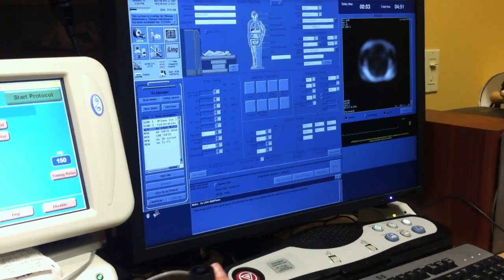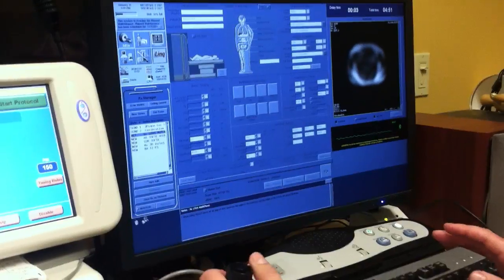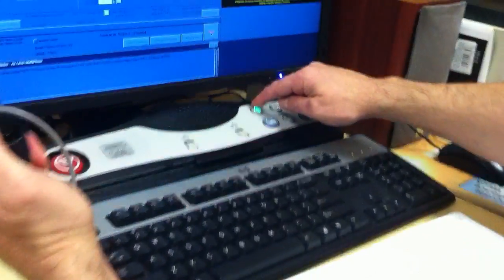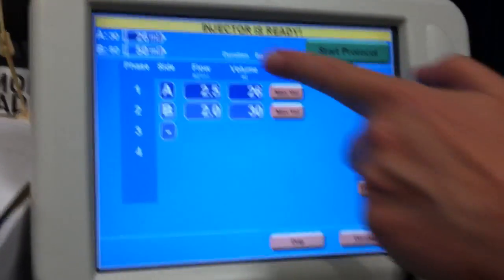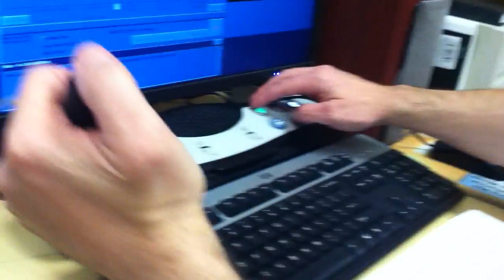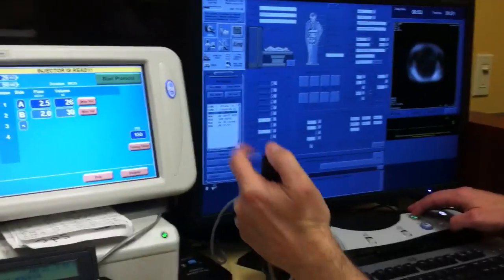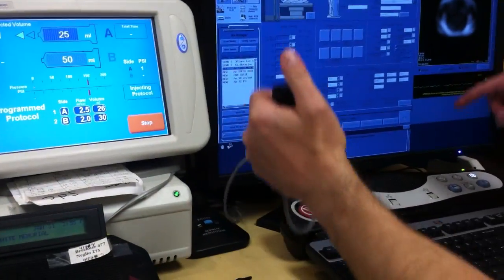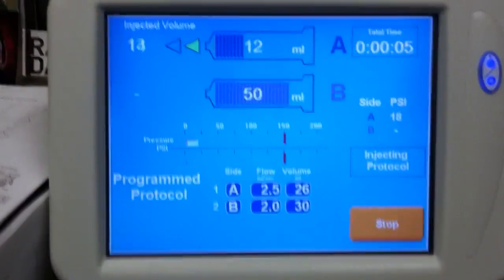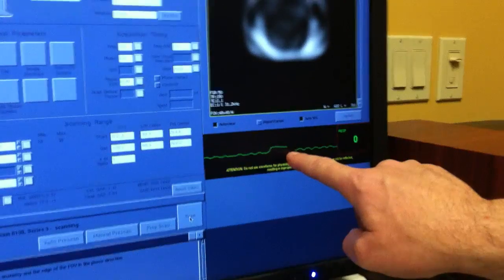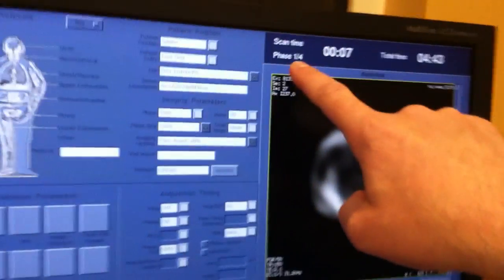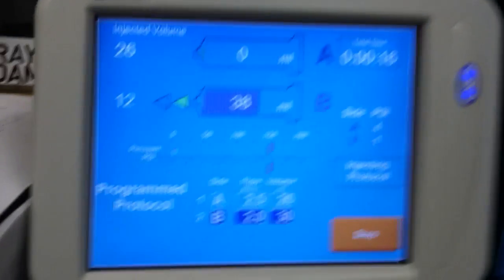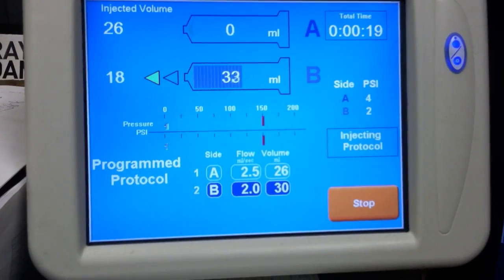Now, again, we're going to do a zero minute and then a 21 second. So, what you want to do is you want to hit this button and this button at the same time. Before you do anything, you need to make sure that your injector is ready. You don't want to hit this button start and the injector doesn't work and you're delayed on your injection. Once everything's set up, everything's good, you hit them both at the same time. And it told the patient to hold their breath. The patient is holding their breath. You see here they breathed in, they're holding their breath. Here's your countdown clock and it's telling you that you're in phase one of four. That's telling them to breathe. It's going to tell them immediately to hold their breath again.